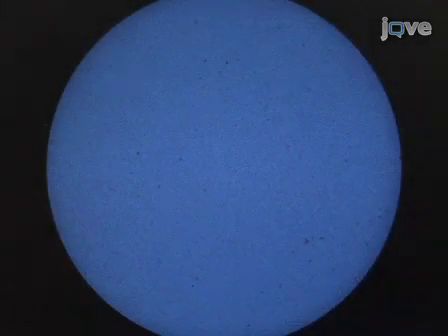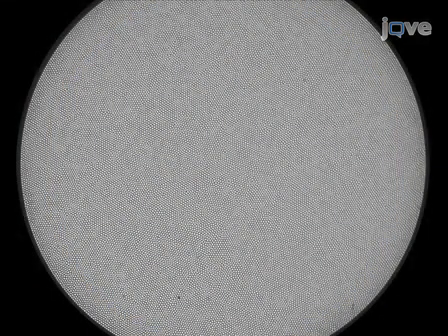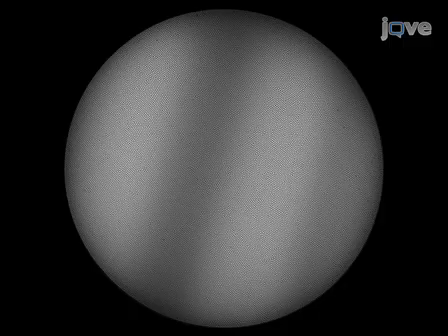Second, the proximal face of the fiber bundle should be uniformly illuminated over its full diameter. As described earlier, this is achieved by configuring the illumination optics for Kohler illumination. The image shown here was acquired when a uniform fluorescent sample is illuminated in this preferred configuration. The corresponding result under critical illumination is shown here. The structure of the LED is imaged onto the fiber bundle face, resulting in the appearance of this unwanted pattern, superimposed upon the true sample structure.